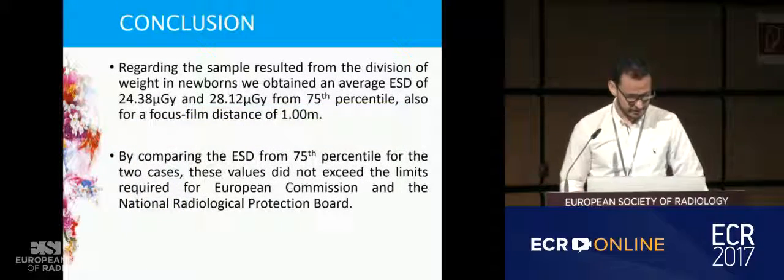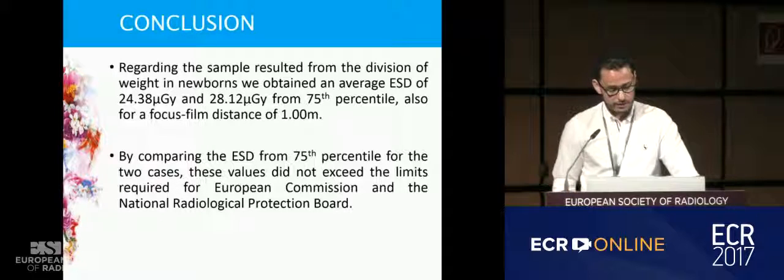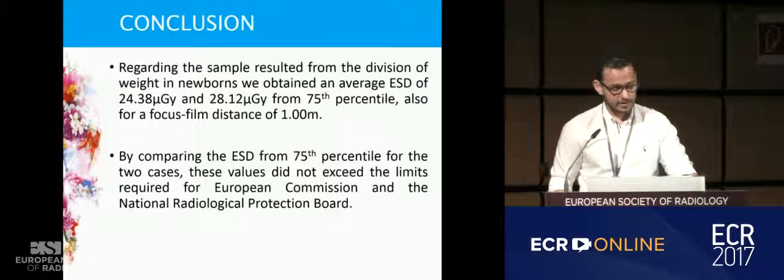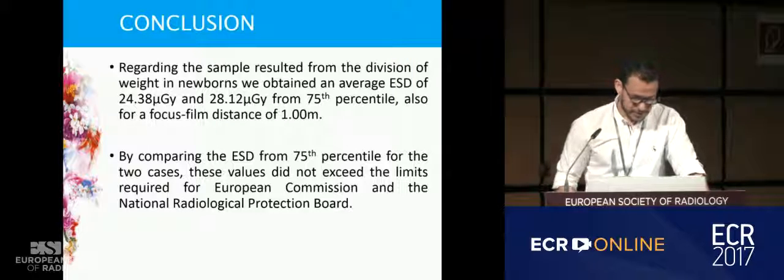the review of the literature. In conclusion, regarding this sample, resulting from the division of weight in newborns, we obtained an average ESD of 24 micrograys and 28.12 micrograys, from the 75th percentile, also for a focus film distance of 1 meter.